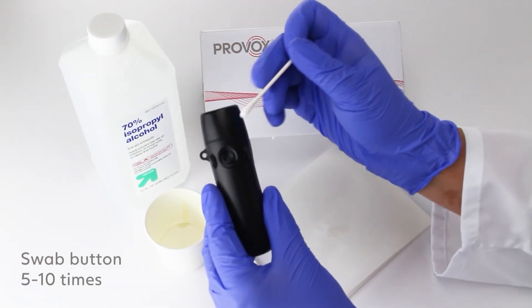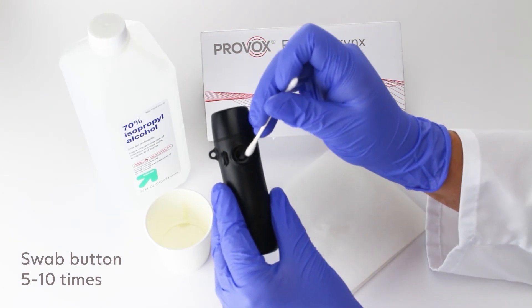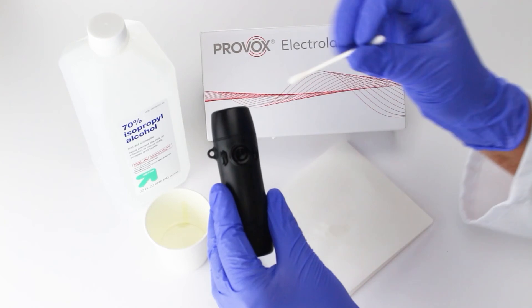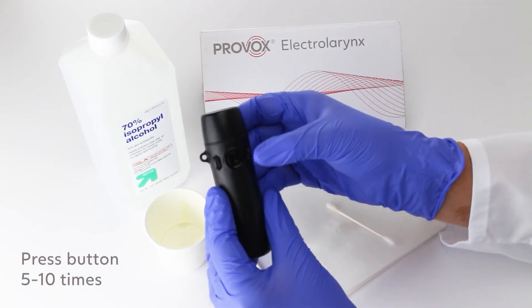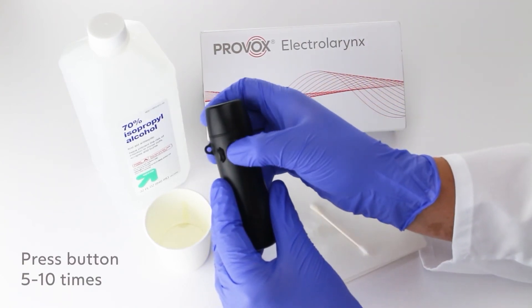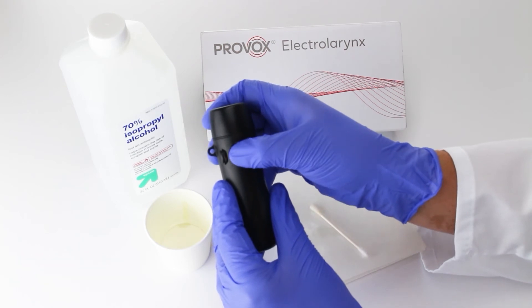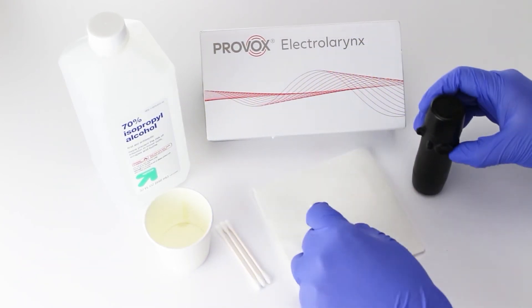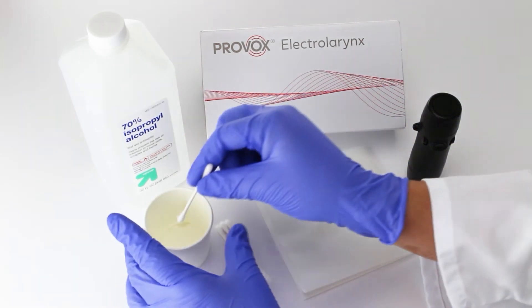Then swab around the power button five to ten times. Next, press and release the power button five to ten times to allow the alcohol to slowly seep into the button cavity. Repeat this process as many times as necessary until the button stops sticking.